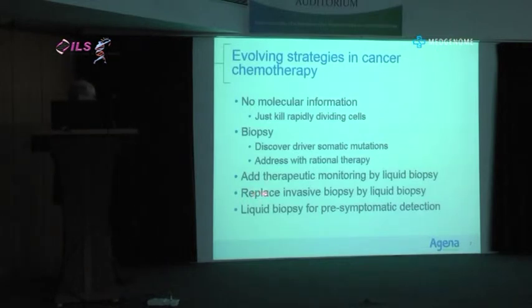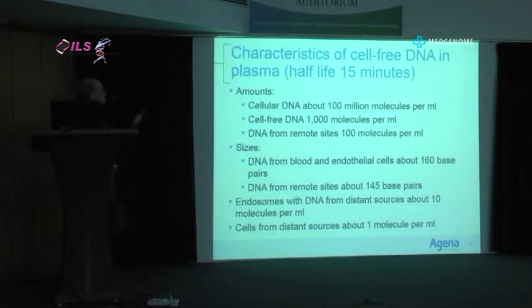So this may or may not become a standard of care. I think you probably know, Darryl already mentioned reimbursement. In the U.S., there is no reimbursement for liquid biopsy yet, so it's all research. At the end of this, I'm going to show you that there may be some chances to actually improve the sensitivity of liquid biopsies, even to the point where we might be able to do pre-symptomatic detection. And of course, that would be a dream, because then you'd have a yearly blood test to see if you were developing any cancer.